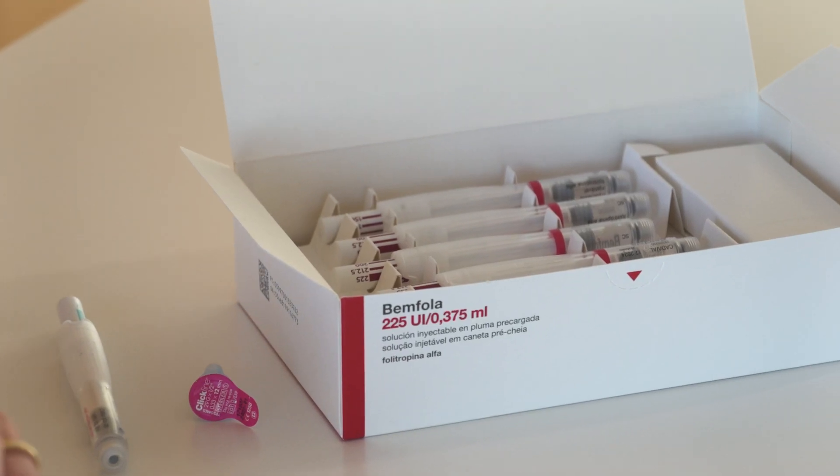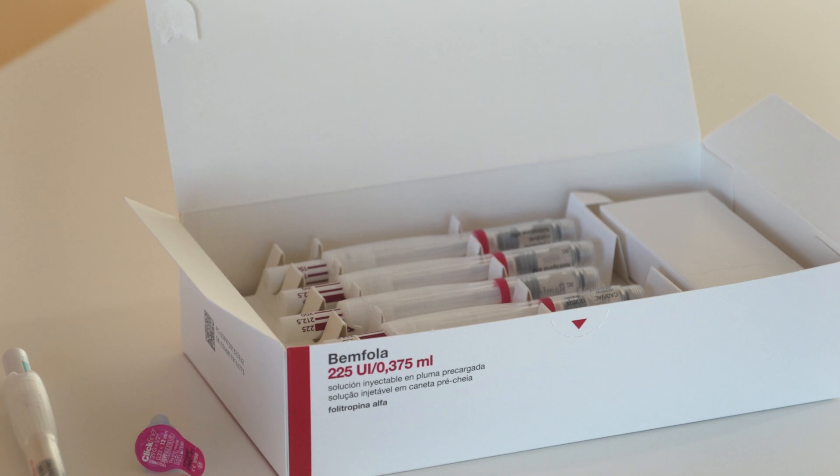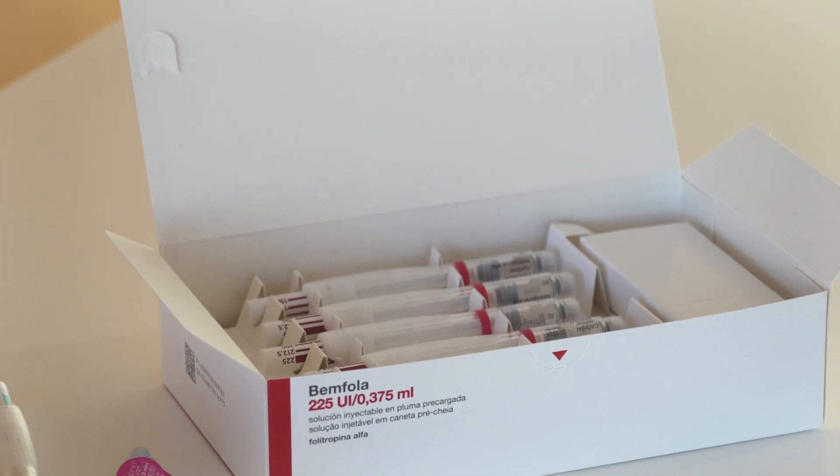Benfola must be kept cool in a refrigerator until the time of its administration, and only the pen or dose that will be administered must be brought to room temperature for 5–10 minutes before each injection. After opening the packaging, you will find several preloaded pens. The medication is already inside the device and is ready for use.